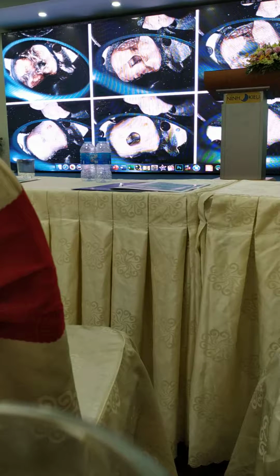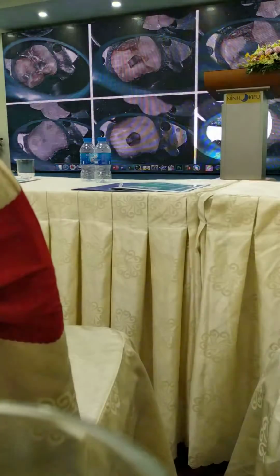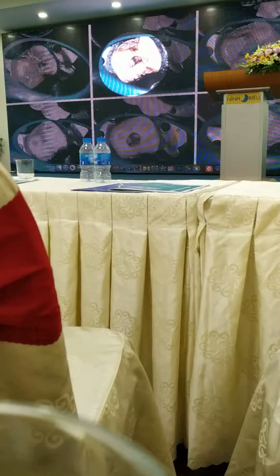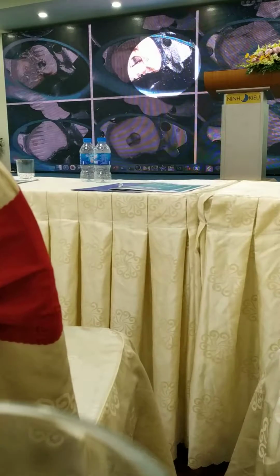In this case, we try to keep as much dentinal structure as we can without touching it. We proceed in the first appointment to remove the old restoration. This is the scenario after removing the old obturation and the caries.